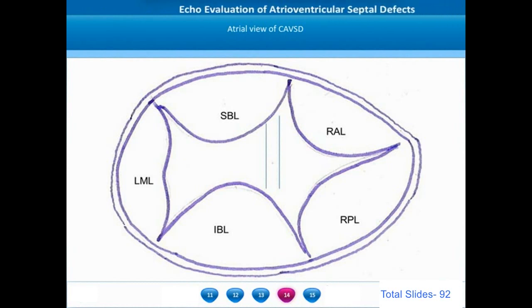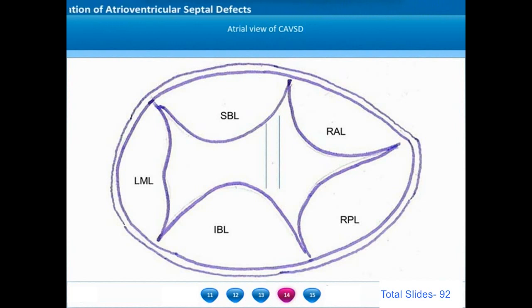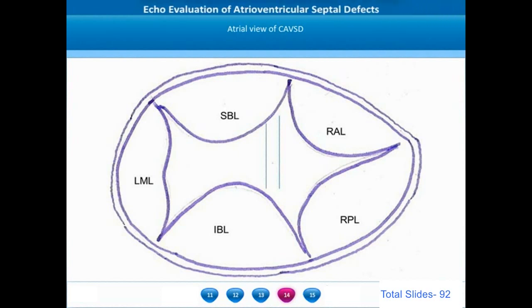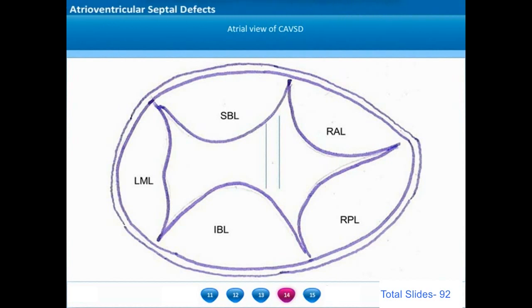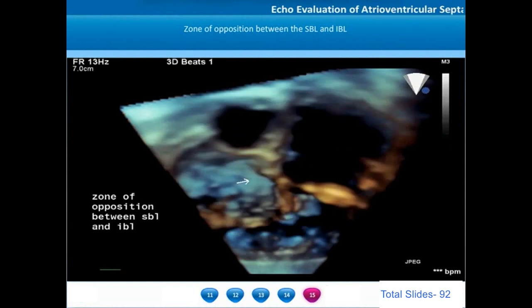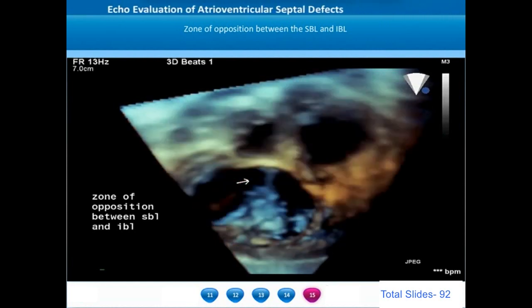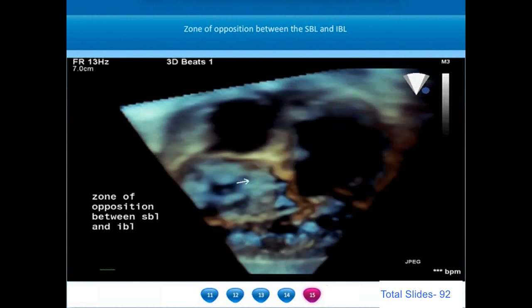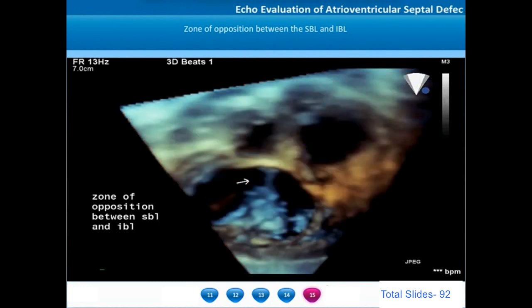From the cartoon atrial view, the left mural leaflet corresponds to the posterior mitral leaflet. The superior and inferior bridging leaflets correspond to two parts of the anterior mitral leaflet. Together, the left mural leaflet and bridging leaflets form the left-sided AV valve component. The right-sided components are formed by the right anterior leaflet and right posterior leaflet. In the atrial en-face view, the superior and inferior bridging leaflets come together in systole to form the zone of opposition.